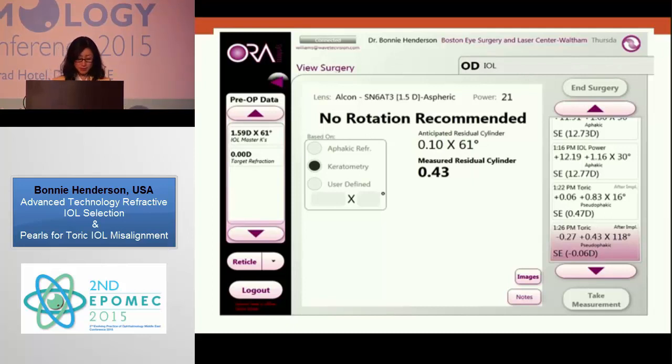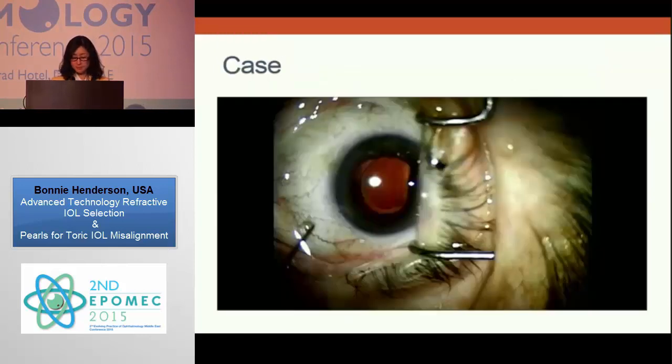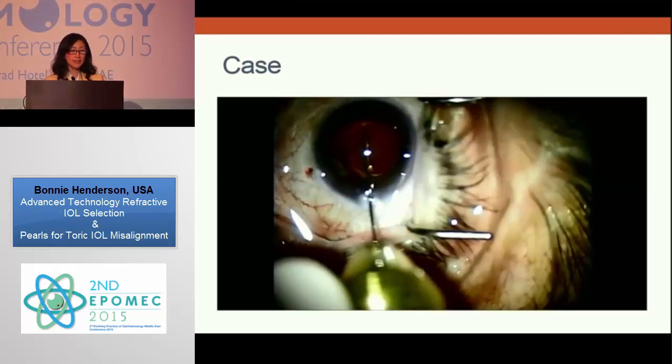All right, let me go back. All right, so if you will play that video, hopefully. Maybe. So this is a video of rotating that lens back into the bag.